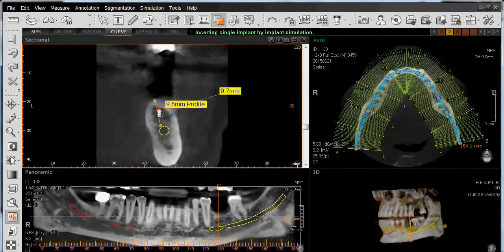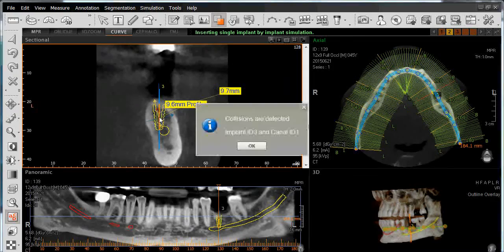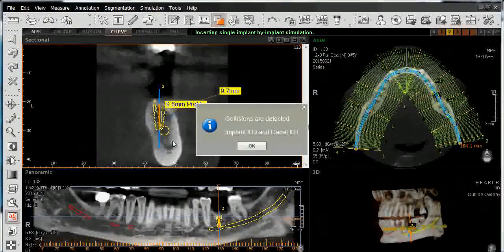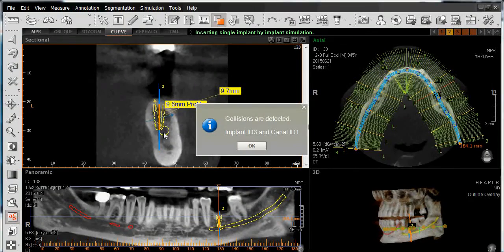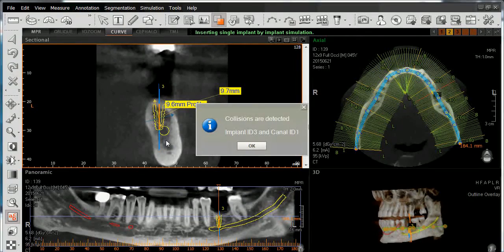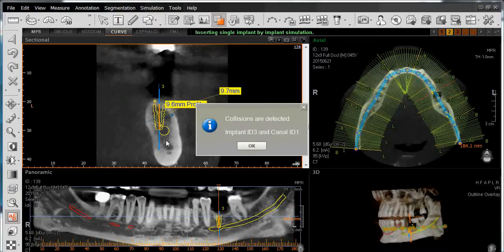Position the implant either in the sectional view or panoramic view and left-click once. Once the implant has been placed, we can then maneuver it as we need to. Note that there is a collision detection identifying the fact that we placed our implant too close to the superior border of our alveolar canal.